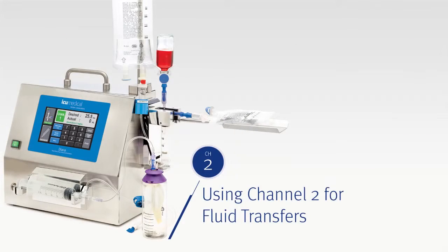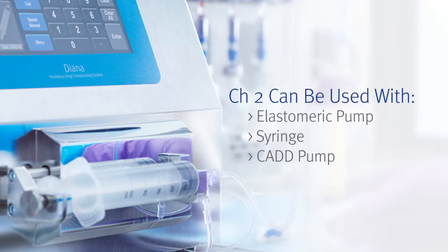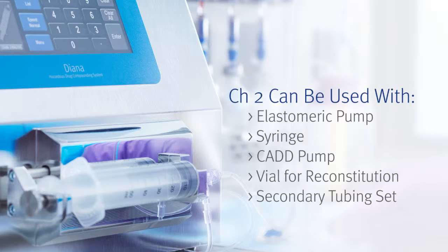Next, we'll demonstrate how to use Diana's Channel 2 for fluid transfers. Channel 2 can be used with an elastomeric pump, a syringe, a CAD pump, a vial for reconstituting powder drugs, or a secondary tubing set. For the purposes of this demonstration, we'll be filling an elastomeric pump.